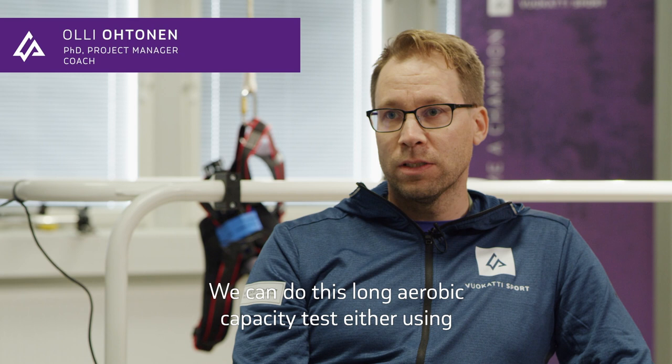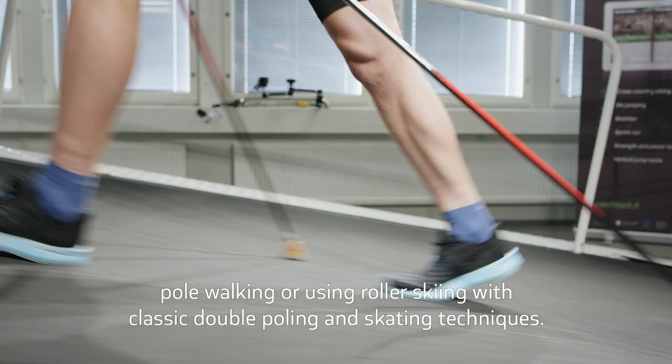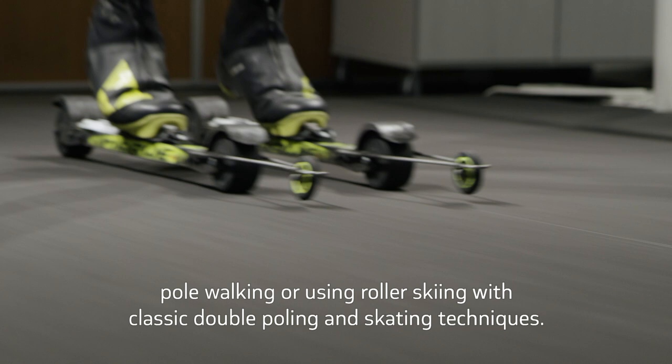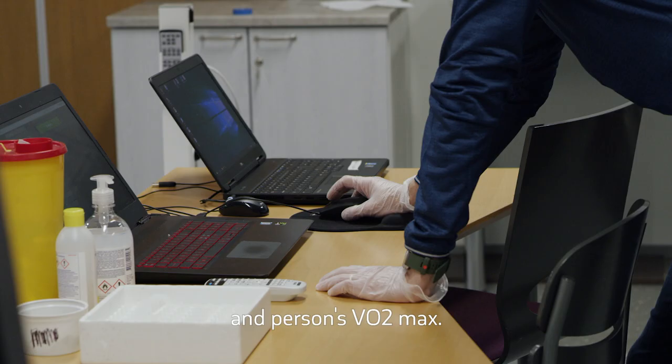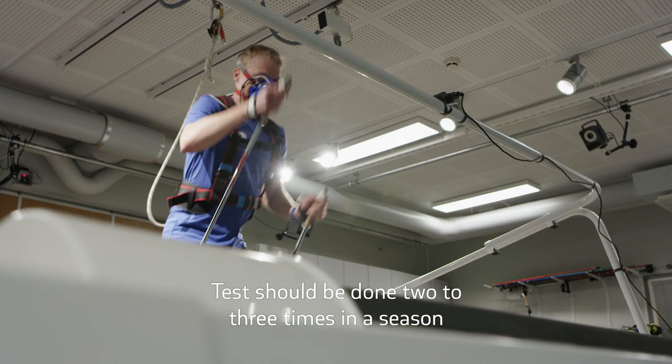We can do this long aerobic capacity test either using pole walking or using roller skiing with classic double poling and skating techniques. From this test we can define aerobic and anaerobic threshold and a person's VO2 max.